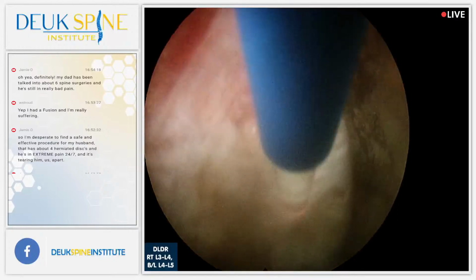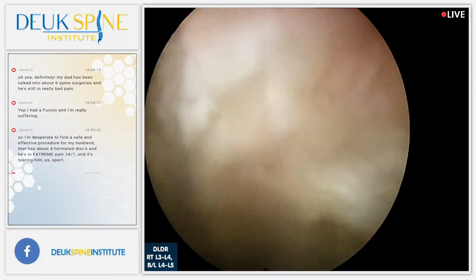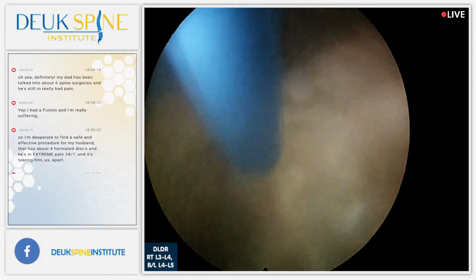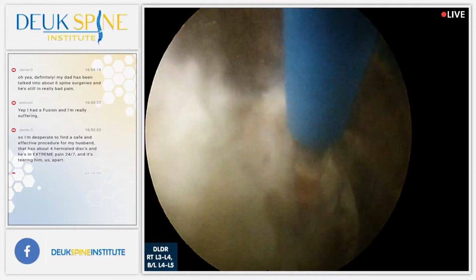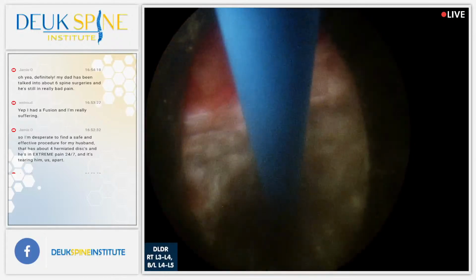It's in the fat right there, so we're not going to get to see it today on her, not at this level. But you got a little scar tissue here, you can see that? I'm just cleaning that up. That's just underneath the nerve. Got to know your neuroanatomy. It's a good thing I know my neuroanatomy. All right, we're done.